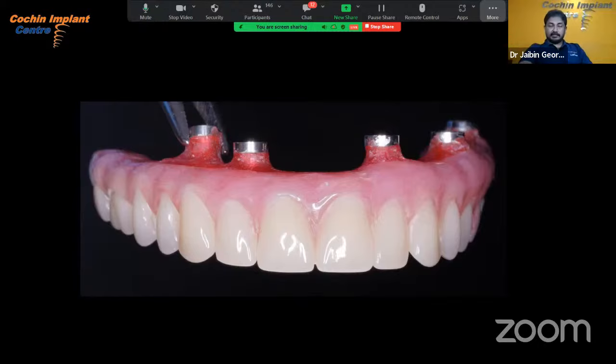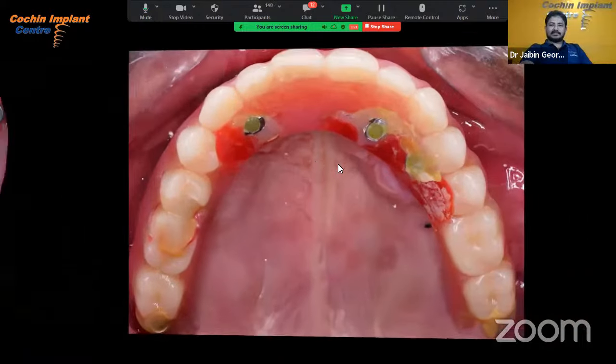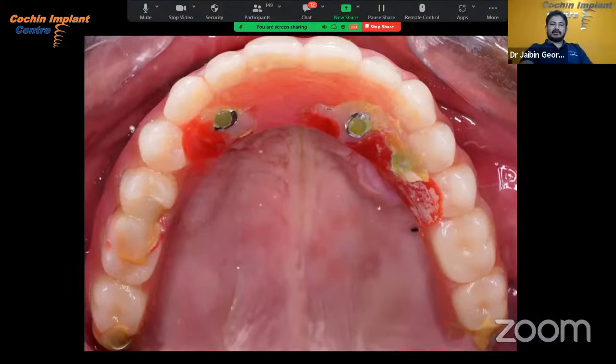A denture was made before. Actually, the patient was a denture wearer. We converted the patient's denture to a conversion prosthesis. You can see the multi-units on the denture. This is the inner surface of the denture. You can see the female part of the screw retained prosthesis. And this is how it looks after the prosthesis is fixed.